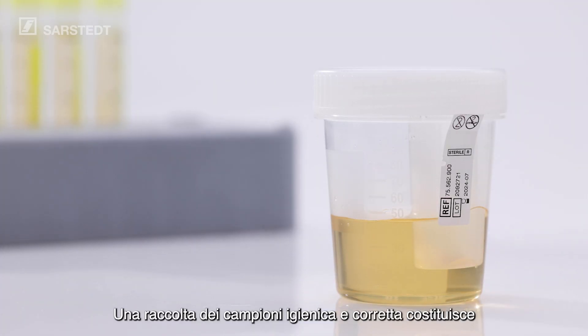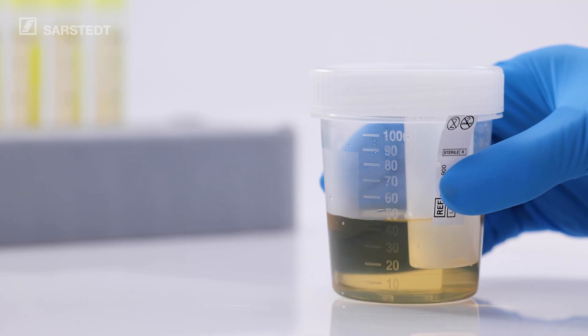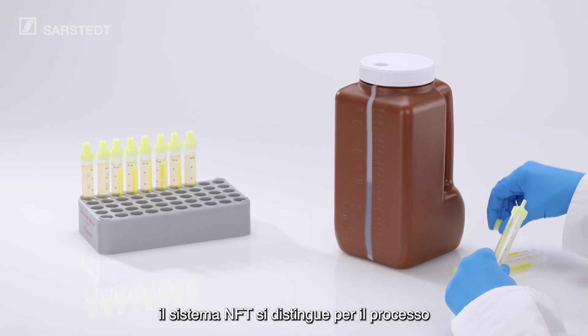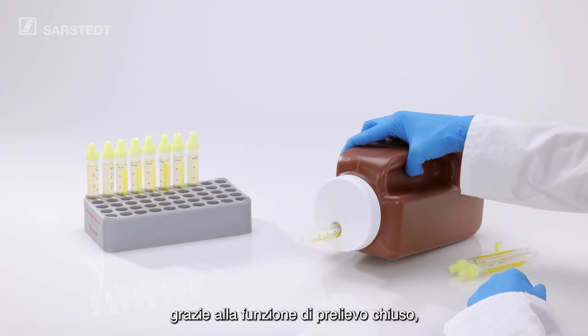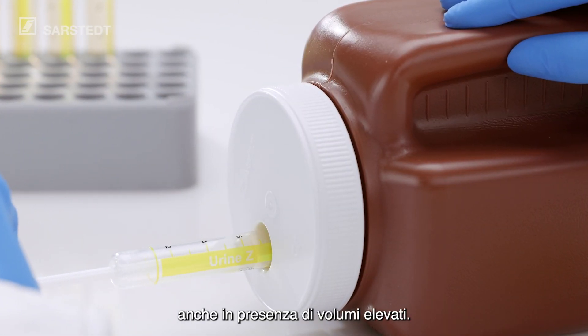The clean and correct collection of specimens is at the heart of every carefully performed urine analysis. The NFT system also offers the benefit of a hygienic and odour-free collection process for 24-hour urine collection. Thanks to the enclosed collection function, specimen collection remains hygienic even with large volume specimens.